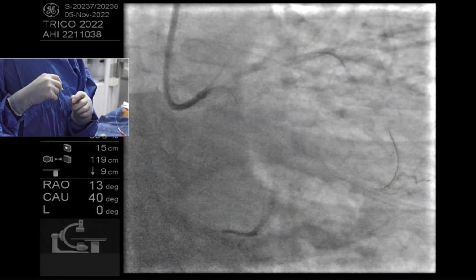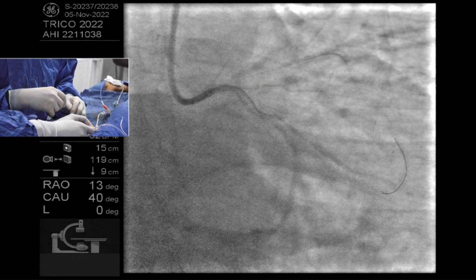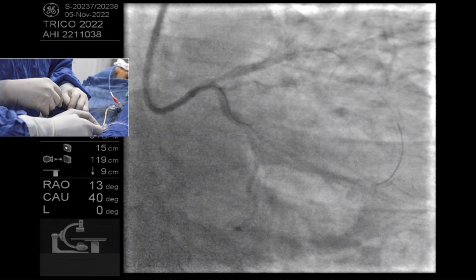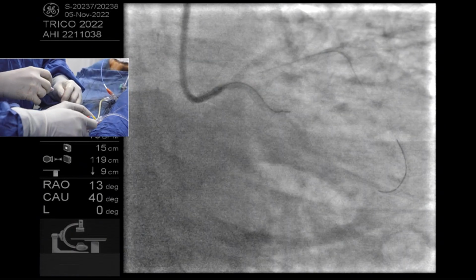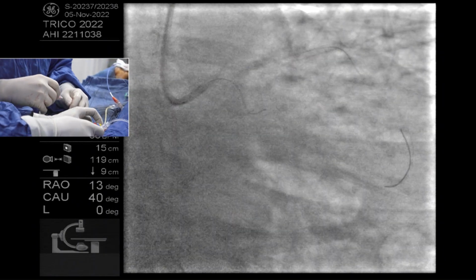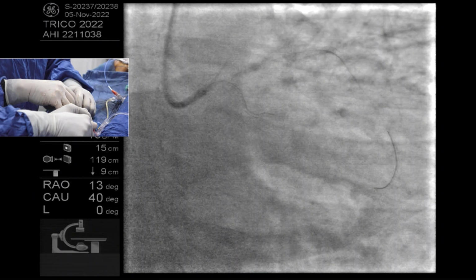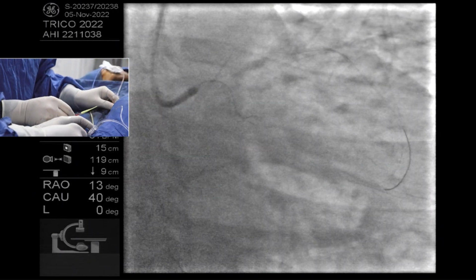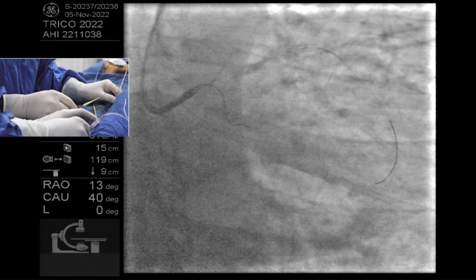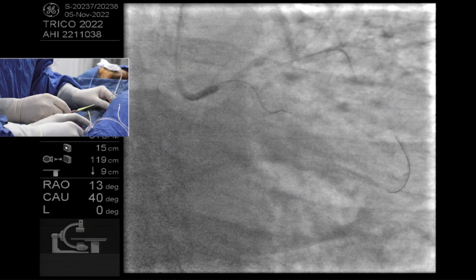Ah, good. Get it. Yeah. Okay. Yeah, great. Now there's a specific flag there. That's where the calcification is. That's difficult. Yes, here is a calcification. So it's quite difficult to cross the wire. So that's why we understand that it was a great decision to take a microcatheter, so you can have some support now.